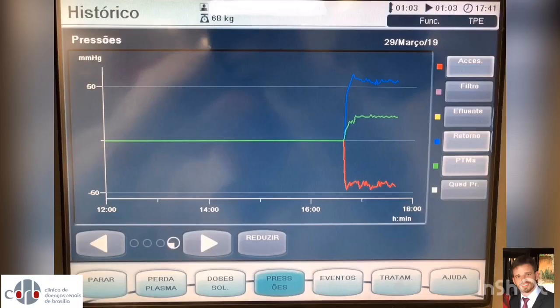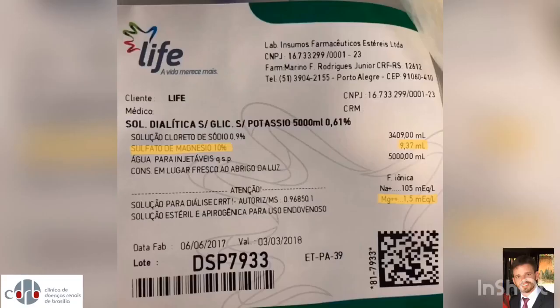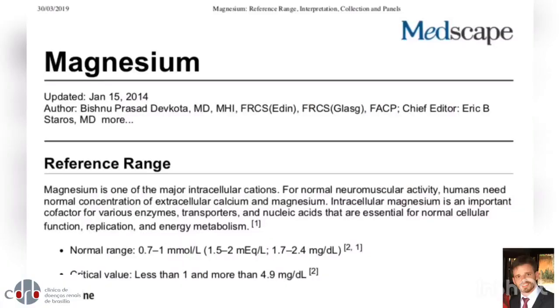After one hour of treatment: transmembrane pressure of 20 mmHg, access pressure (red) minus 50 mmHg, and return pressure (blue) around plus 50 mmHg.